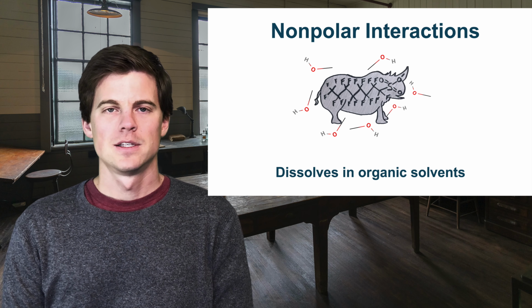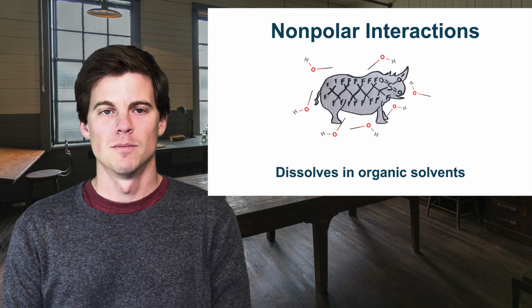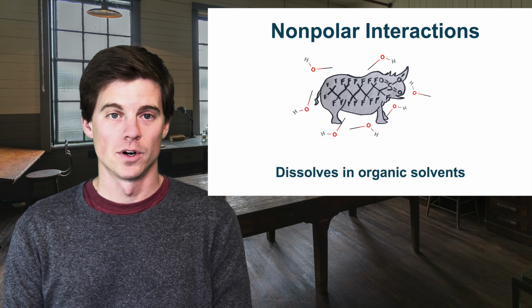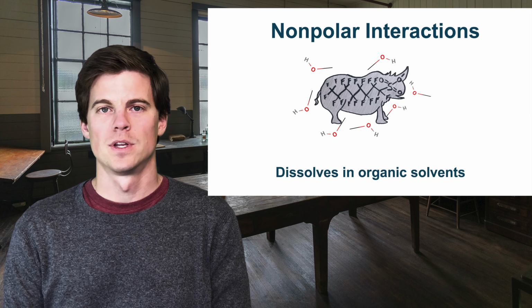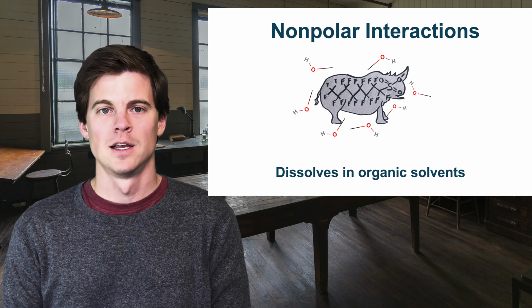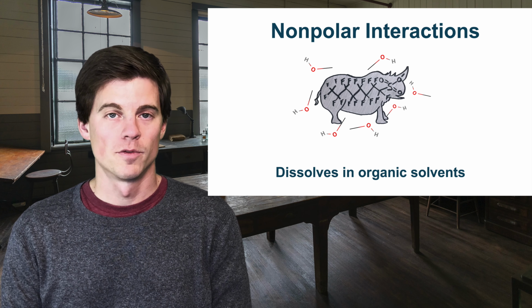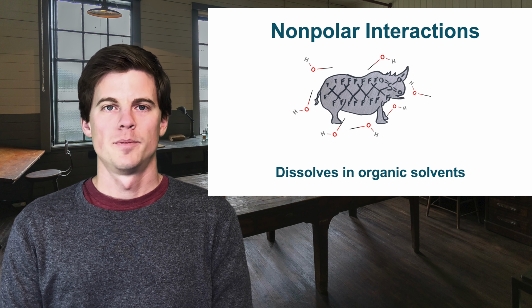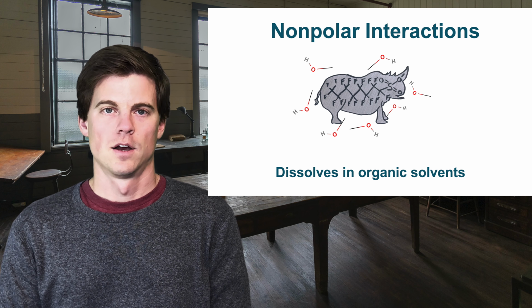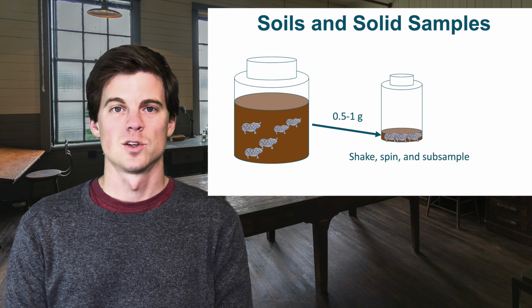So what happens is if you have a protic solvent, especially like methanol, you get these nonpolar interactions, and you can see methanol might have nonpolar and polar interactions. With that CH3 group on methanol, you would get interactions with the fluorocarbon chain, and with that OH head group, you'd get interactions with the head group of the PFAS. So this is a way to get PFAS into solution, because they have a good strong affinity for things like methanol, and they get completely solvated.